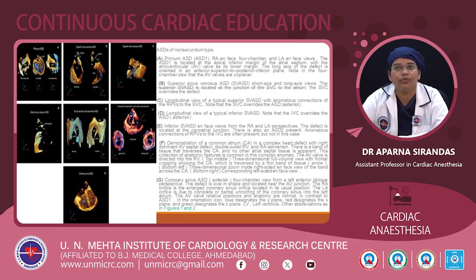3D full volume view with frontal cropping showing common atrium which is traversed by a thin band. In this you can see that arrow 1, it is a thin band of tissue. 3D zoomed mode, right sided en face view of the band across the common atrium, and one more is a corresponding left side en face view.